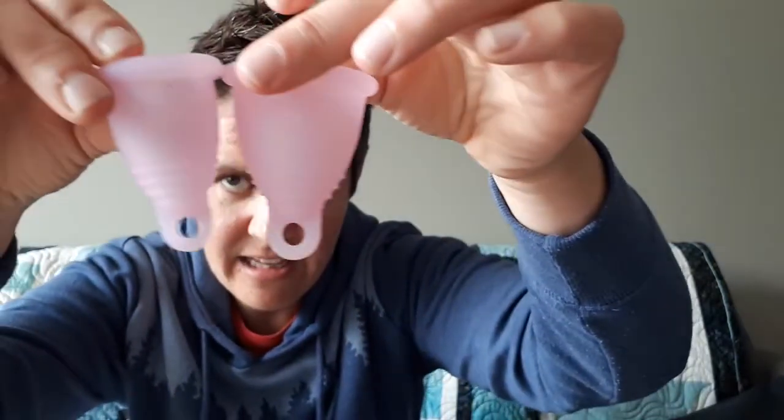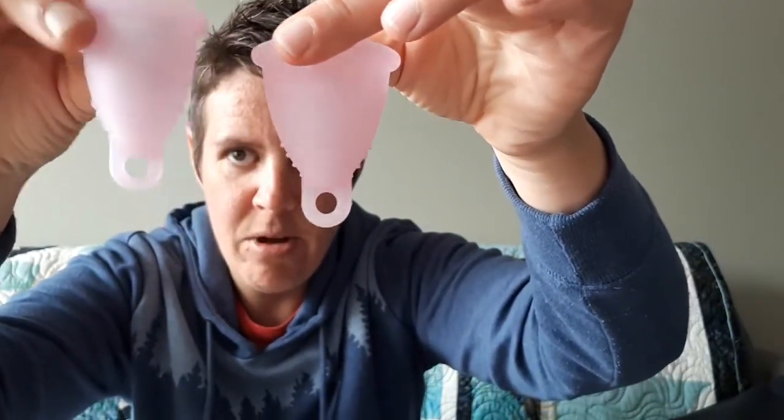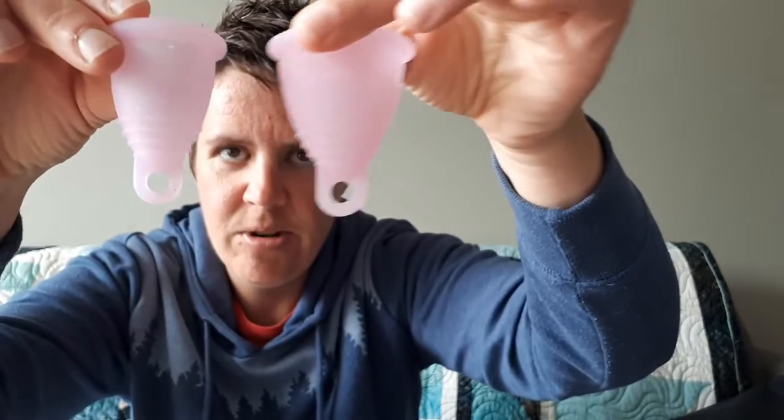Let's take a look at the total length. The small one on this side is definitely shorter than the medium one.